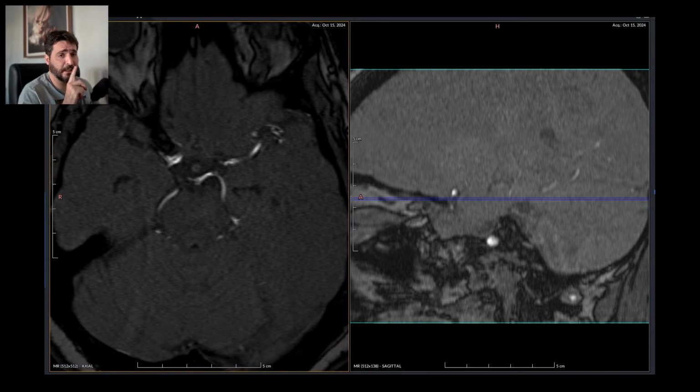Those scanners are almost as expensive as a regular scanner, and it is impossible to do proper maintenance and to upgrade them. There is no way you can upgrade such an old machine. I have seen some cases that made me want to ask the owner of the clinic why he kept insisting on such old machines, but I guess those guys are married to the machines.